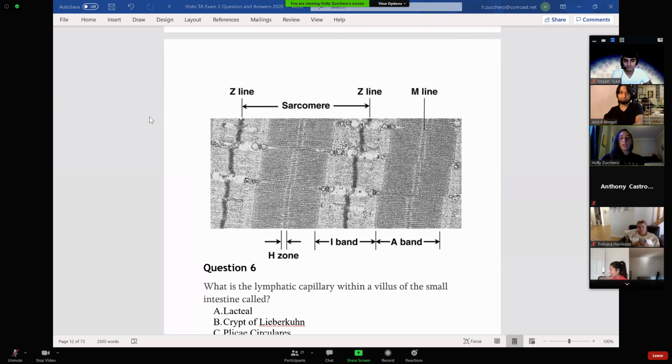It's not a large change in length. They're coming in closer to each other.